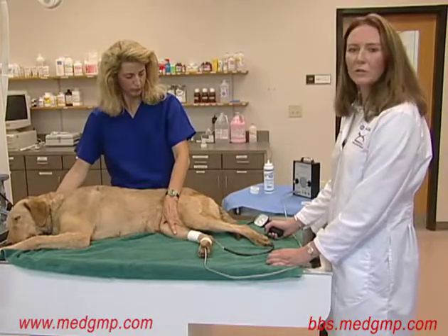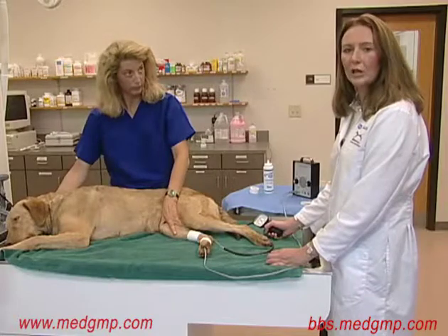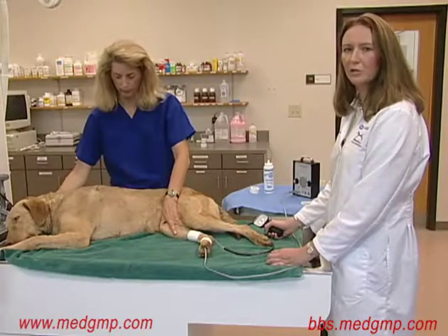It's also important to record all your measurements in the medical record, along with the cuff size used and the place of blood pressure measurement, for future reference.